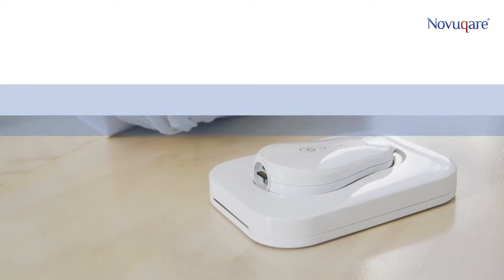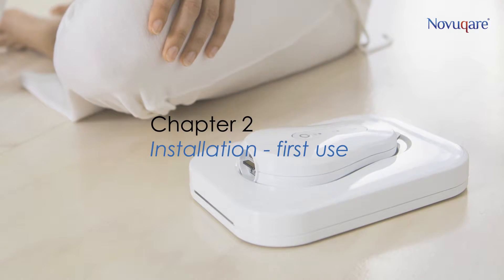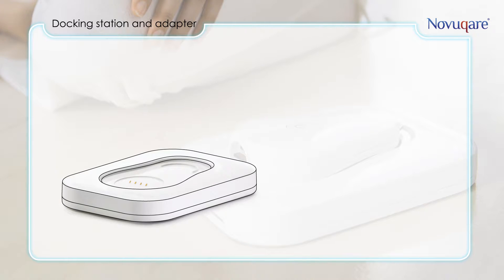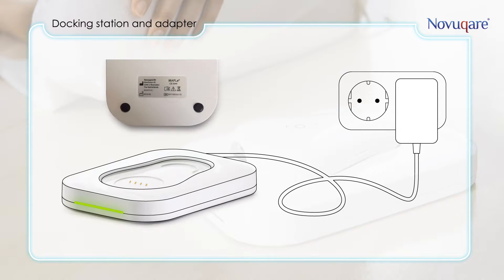This part will show you how to install the system. To turn on the docking station, first connect the cable of the adapter to the docking station, then put the adapter in a free plug to connect to the power grid. The docking station will light up green. The Wi-Fi is now established and ready for use.